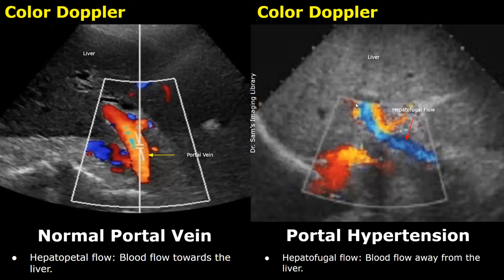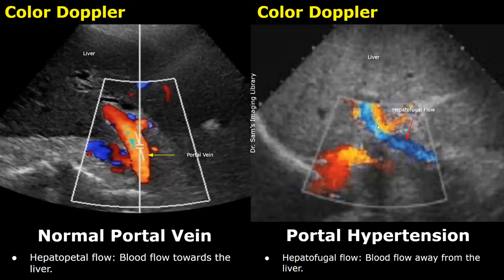This is a case of portal hypertension. In portal hypertension, the pressure within the portal vein increases due to increased resistance to blood flow. This can occur in conditions such as cirrhosis, where there is formation of scar tissue in the liver, which increases the resistance to blood flow in the portal veins.